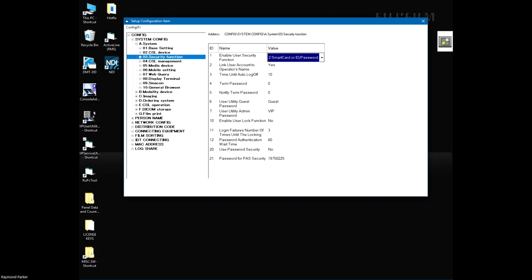What that does is it makes the technologists happier. They will not be constantly prompted to change passwords every 3 or 6 months. And these are pretty secure. So it's more just to link the imaging that is performed or rejects that are performed with that technologist's name. I do keep 10 to no so that the user doesn't get locked out after 3 attempts. Login failures, again, setting it to 3 is pretty good and fair. And that's about where I would leave this.